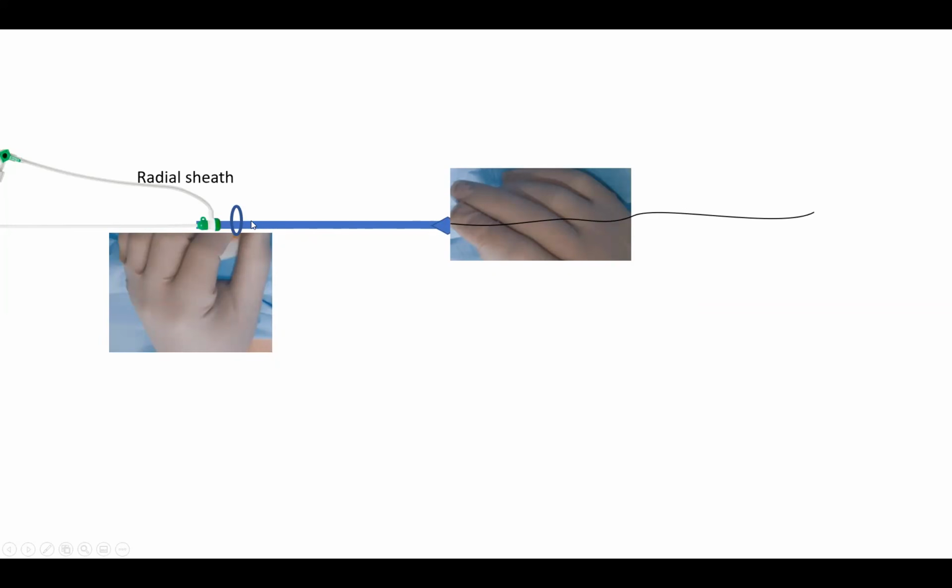and that hand goes in sync with it. It facilitates the movement of that. So with both hands, you clock, with both hands, you counterclock. As you're advancing and pulling and torquing initially, you have the wire in all the time. So somebody is loosely holding that wire for you. Both your hands are on the catheter, one in the back, one in the front.